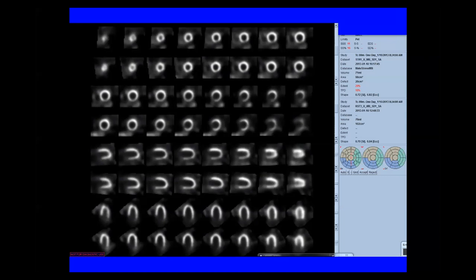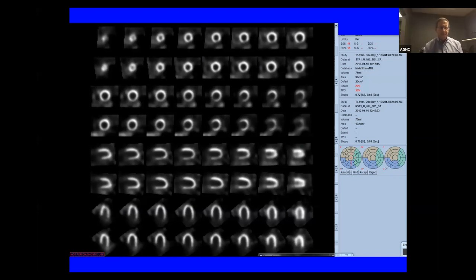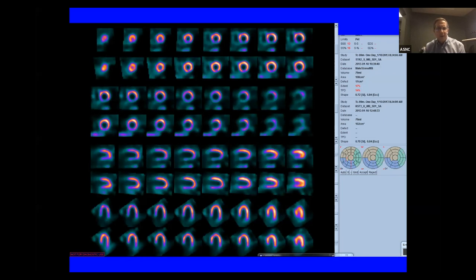The rest image doesn't have as big of a perfusion defect inferiorly if you compare both the supine and the upright images. So there is a reversible defect in the inferior wall in the RCA territory. So it's a small infarct with a moderate degree of ischemia. It's an abnormal study. So it's at least a moderate size, moderately intense, partially reversible defect. I agree. Here it is in color. It looks a little bit bigger in color.